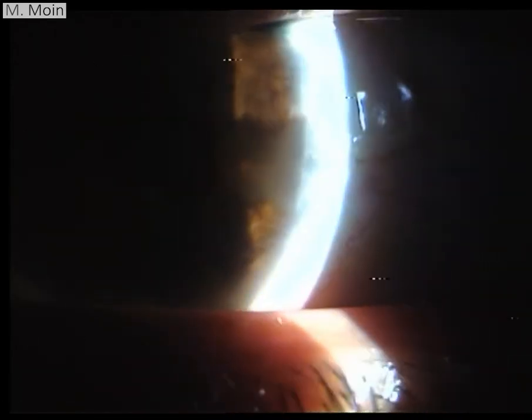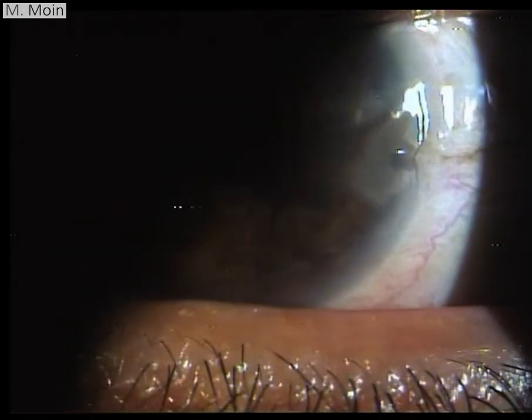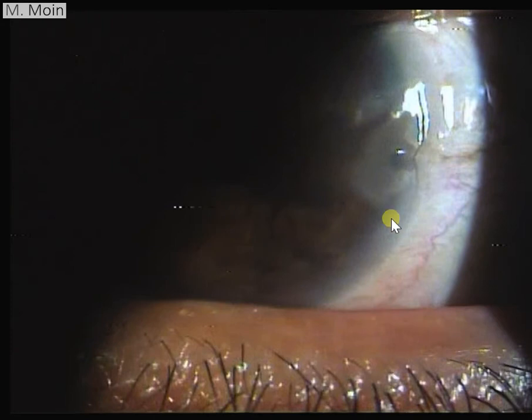Let's go and quickly have a look at the other eye of the patient to see that this patient also has some area of, what do you see over here? This is an area, interesting enough, of a descemetocele over here along with this area. This seems to be like band keratopathy over here. Let's get a clear view of what we're seeing and go forward on this.